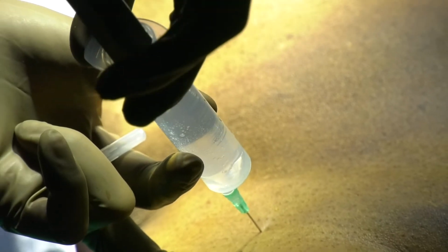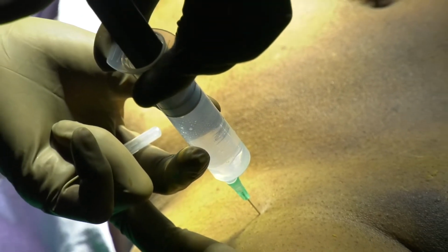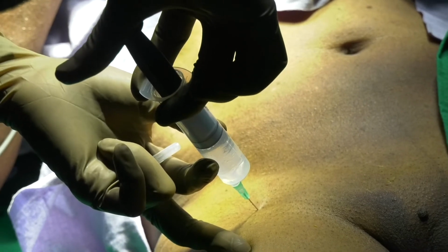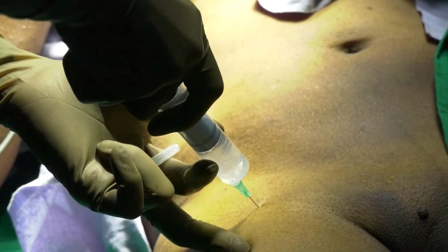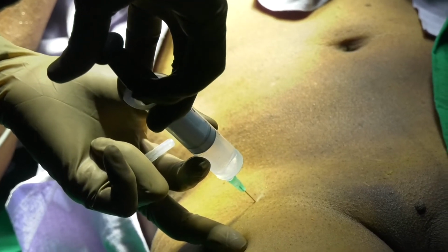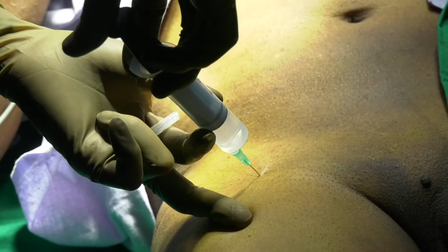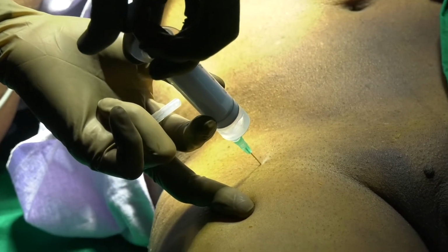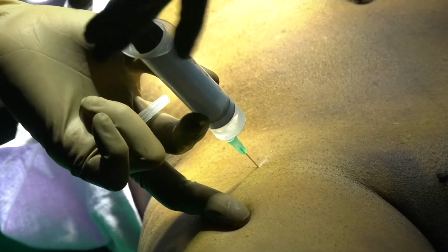Now I will inject the drug. Usually lignocaine is taken for immediate effect, but we are utilizing the vial of 0.5% levobupivacaine to the full extent. Aspirate in between.